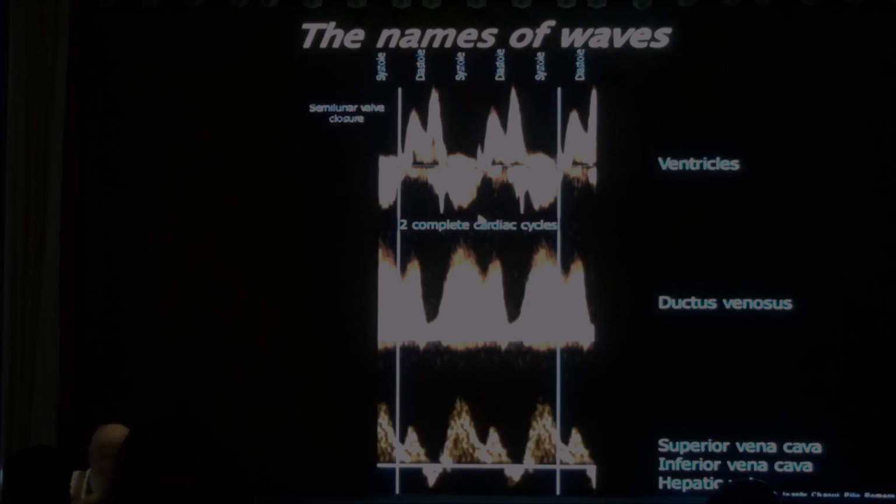So when we do some demonstration, I want you to look at the tracing and not get some sort of wiggly line where you can measure the heart rate. That is not sufficient. I want you to try to get E, A, V and there's two tracings.